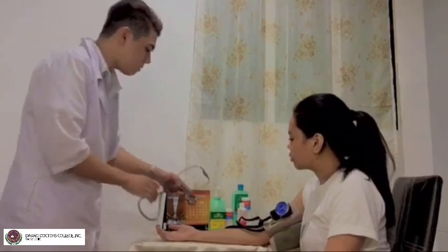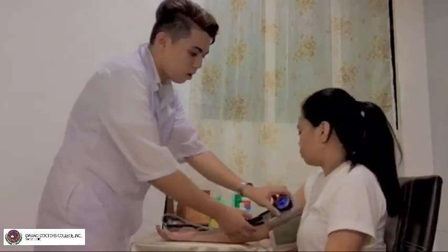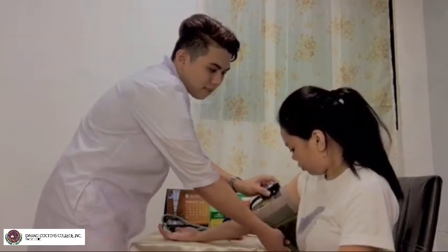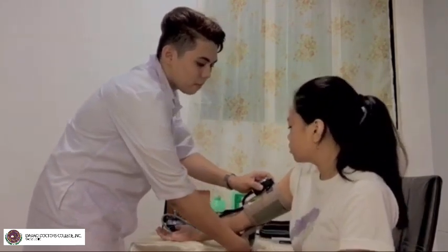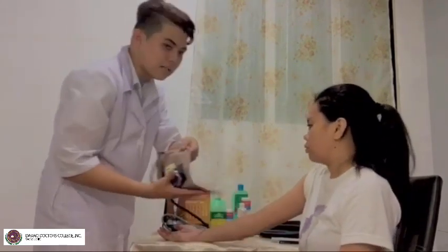So now we need to remove the cuff from the client's arm. Okay, ma'am, tanggalan na nako, ma'am, ha. And by the way, your blood pressure is 110/70, which is normal, ma'am. You are good. You have healthy vital signs.